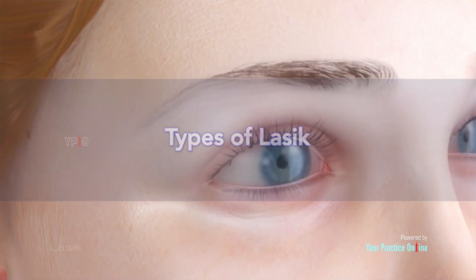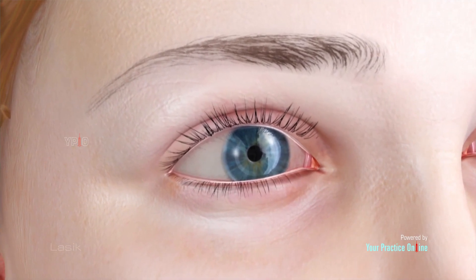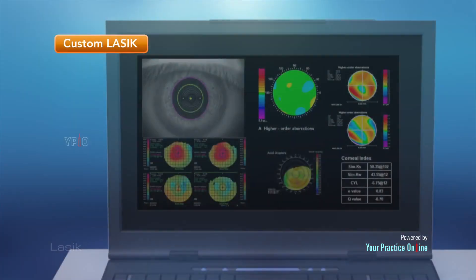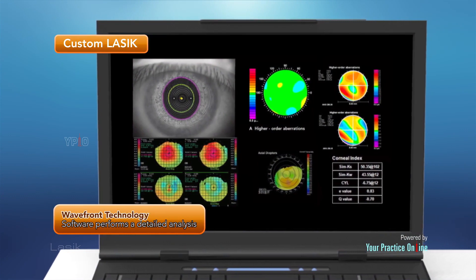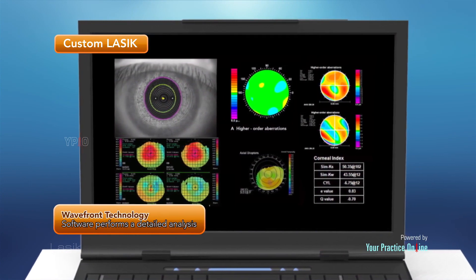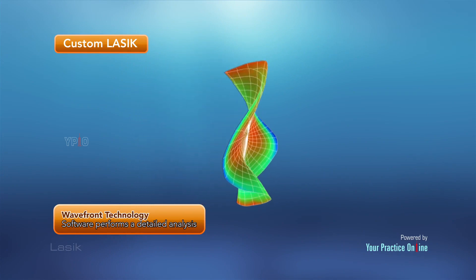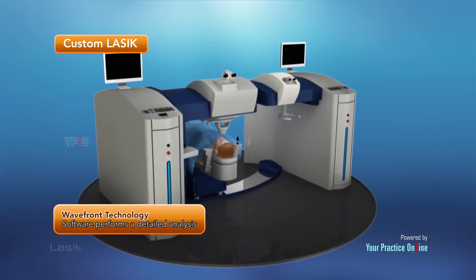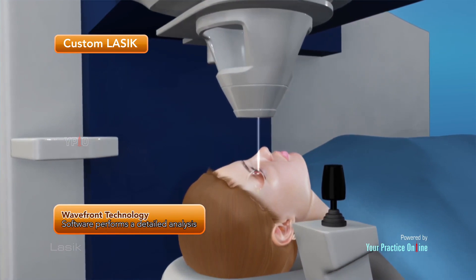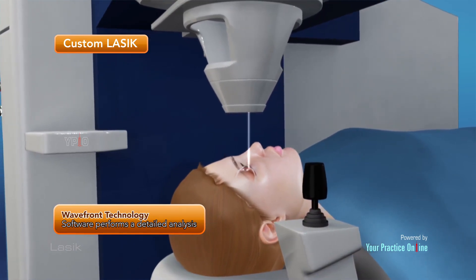Different types of LASIK procedures are available and your doctor will determine the appropriate type of surgery depending on your specific condition. Custom LASIK employs wavefront technology, software which measures precisely how light travels in your eye. The software performs a detailed analysis of how your eye processes images, and this information is sent to the laser for your doctor to perform the procedure and alter your cornea. Wavefront technology helps achieve individualized vision correction results impossible with conventional LASIK surgery.